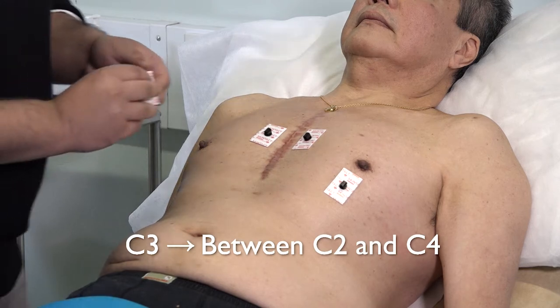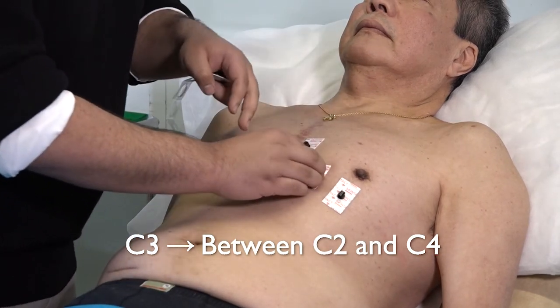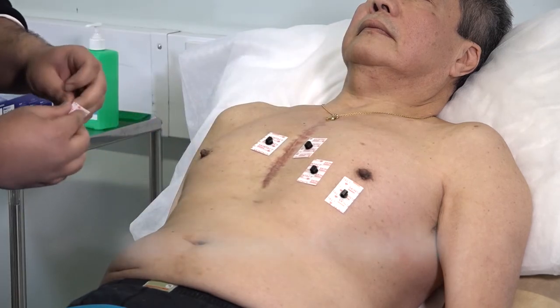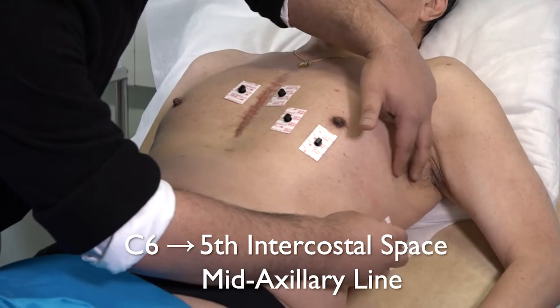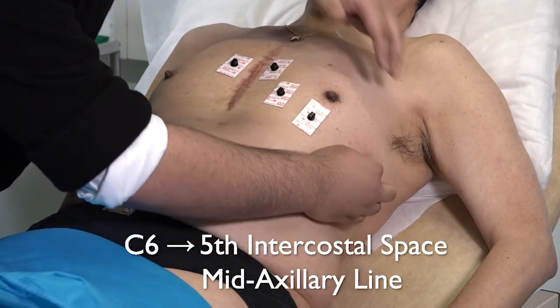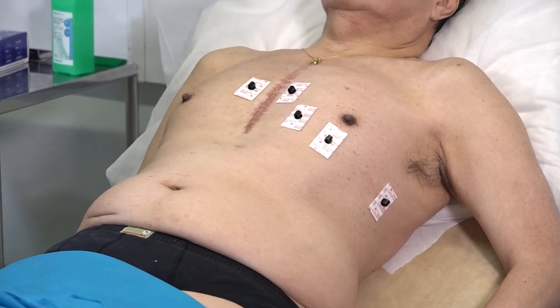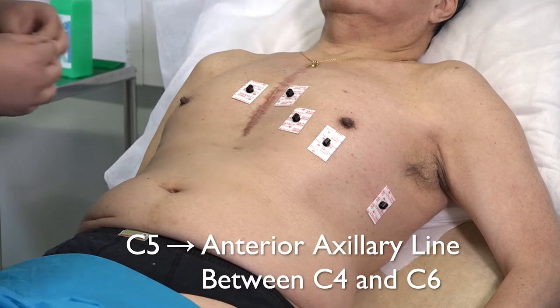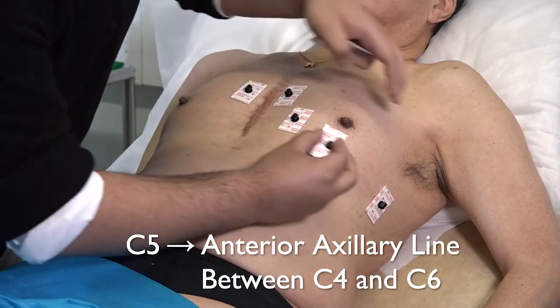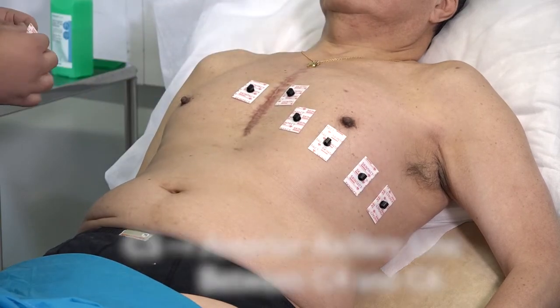Now place chest three between chest two and chest four. Place chest six in the fifth intercostal space, in the mid-axillary line. Place chest five in the fifth intercostal space, between chest four and chest six.